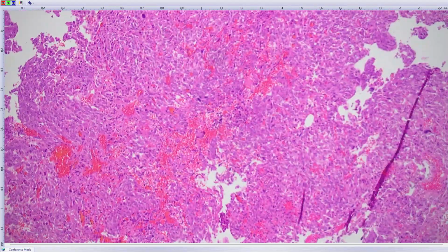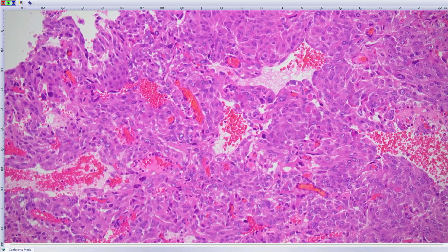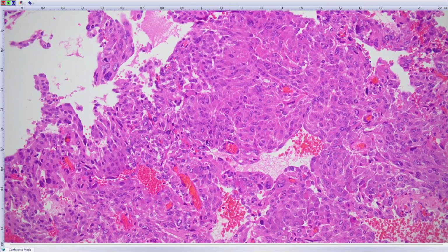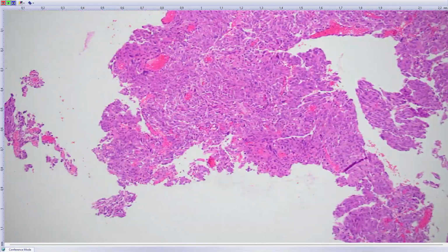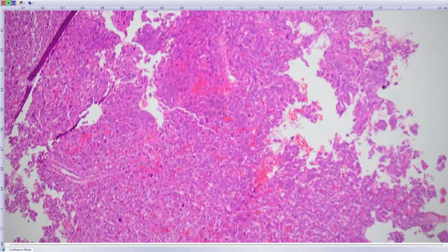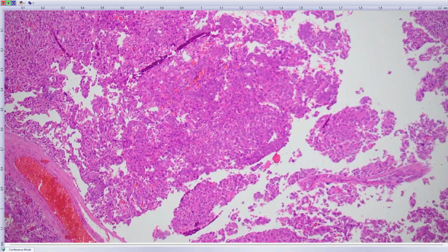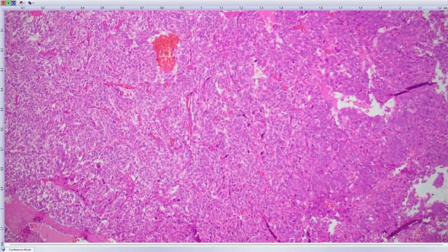I don't know the exact location other than retroperitoneum. There are like many scoring systems for malignancy. It's unclear which one to use, but this one looks like a malignant example based on any of these schemes, because there's high cellularity, a lot of atypia, a lot of mitotic activity, and there's also Ki67, which is kind of important for these scoring systems, which was relatively high.